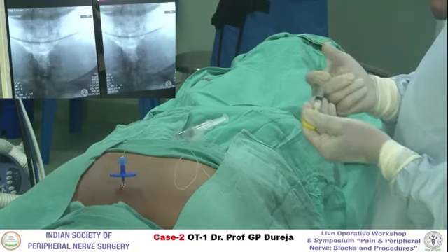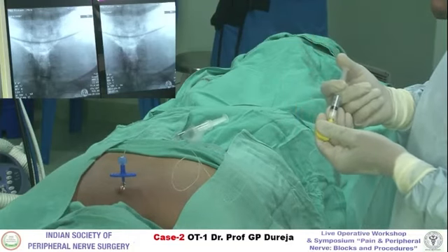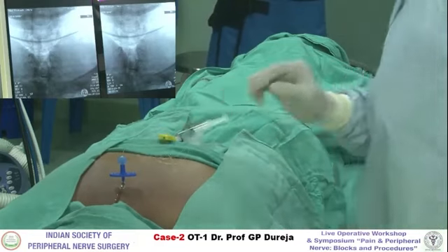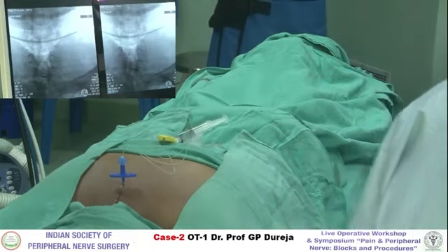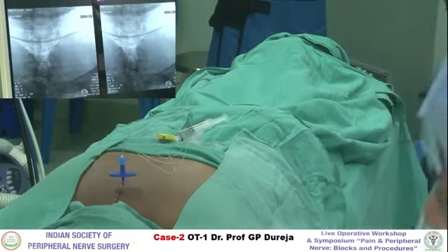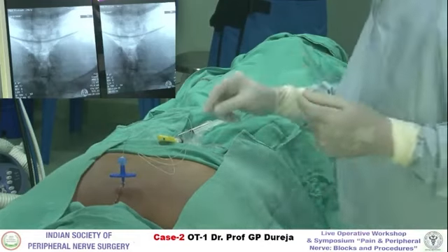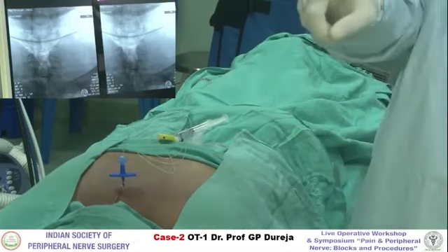And one more thing, sir. This catheter you have inserted inside, it's having only one hole at the tip, or there are multiple holes? No, there are multiple holes. There is no hole at the tip. Along the whole length, which is there inside the interspinal canal, the whole area will get the drug. Yes, I will show you the catheter when I take it out. But I wanted to show you the C-arm now.